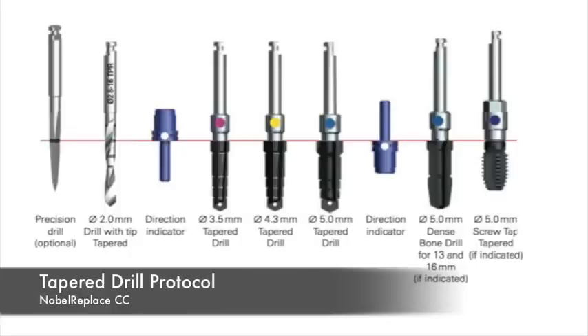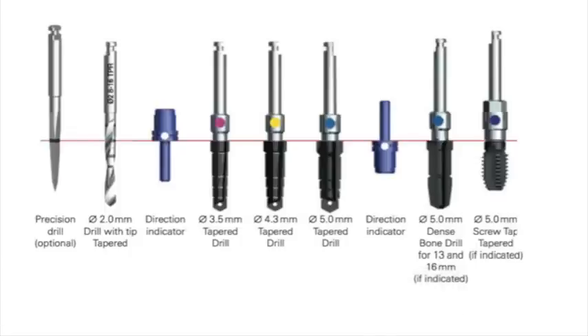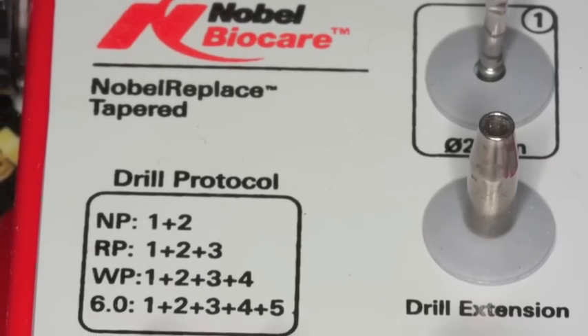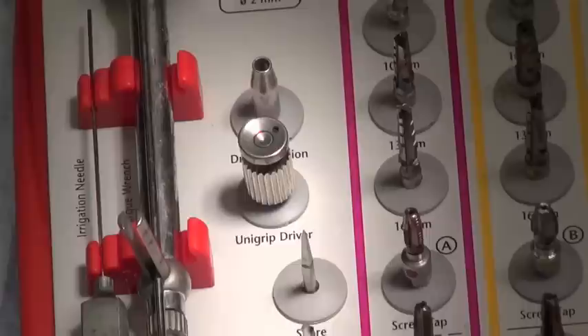The tapered drill protocol is an implant protocol based on implant length first and then width second. It's a very simple system to use. The protocol we're going to use today is the WP protocol 1, 2, 3, and 4.